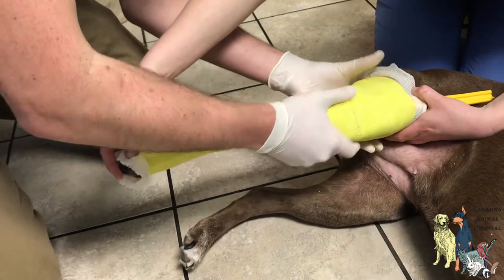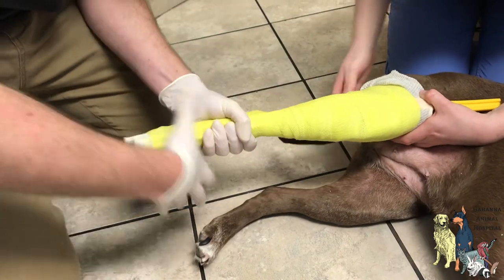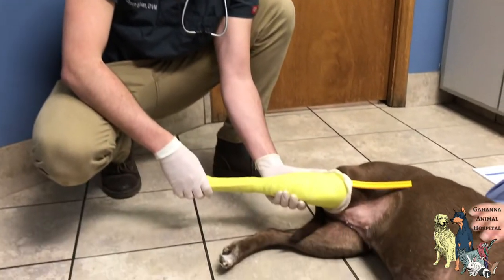Now we massage and make sure that it's really sticky. Make sure that it gets on there. Georgia is being really good for this and the cast is rock solid. Georgia is a good girl.